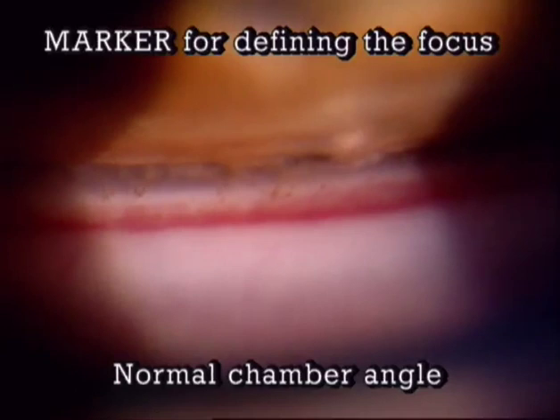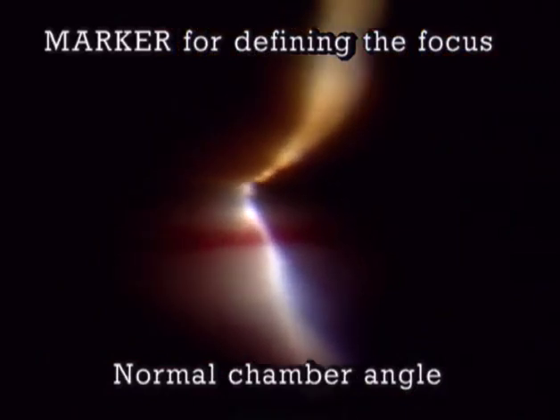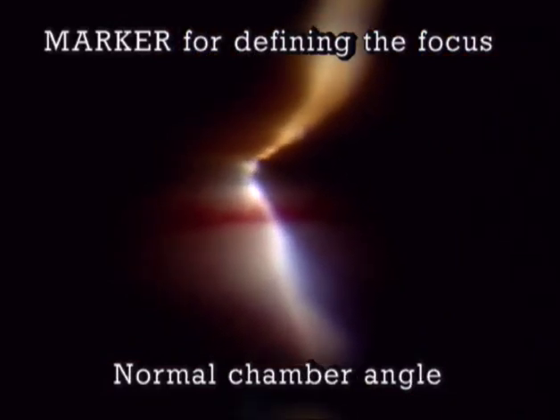Furthermore, the optical knife can be used as a marker for defining the focus of the microscope in the examination of poorly defined patterns. For example, in this chamber angle, both the trabeculum and the blood in Schlemm's canal have indistinct margins. Is this fluffy appearance due to inexact focusing or to a real fluffiness of the tissue? Since it is here possible to produce a sharply defined slit image, the microscope is in focus, and thus the fluffy appearance is due to fluffy tissue at the corneoscleral trabeculum.